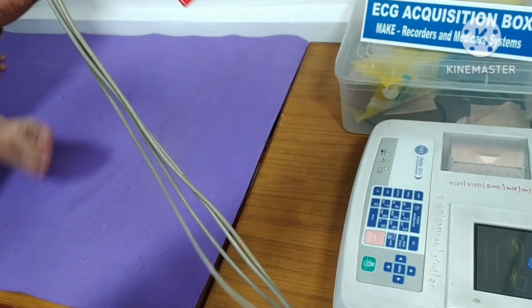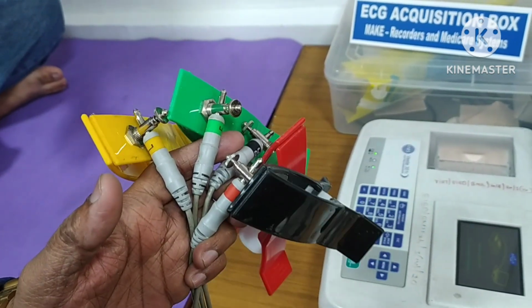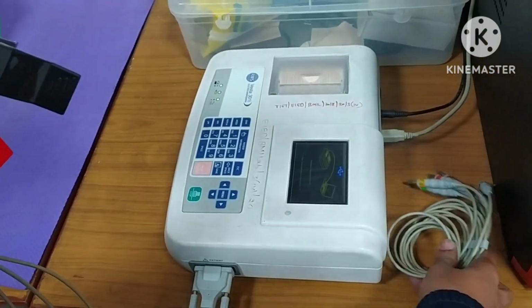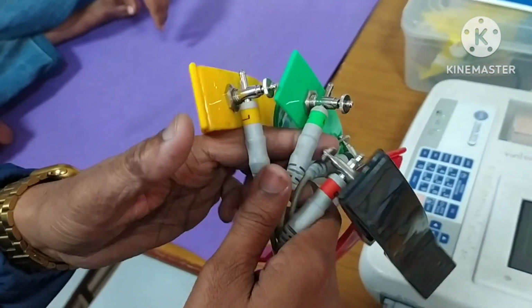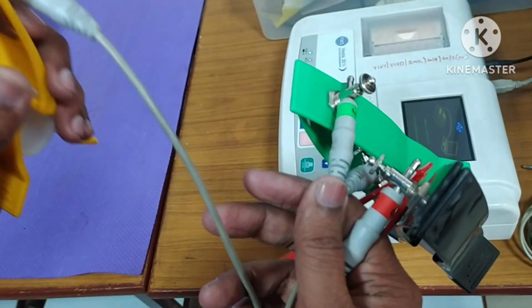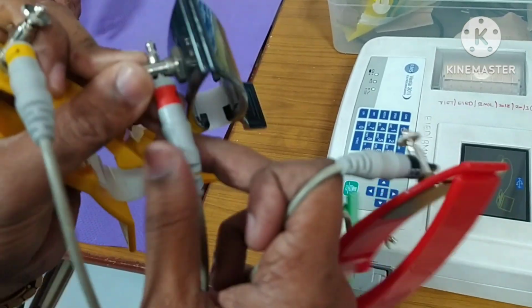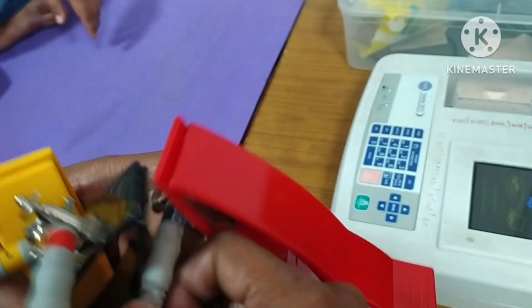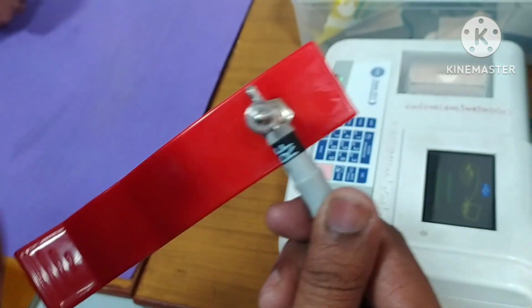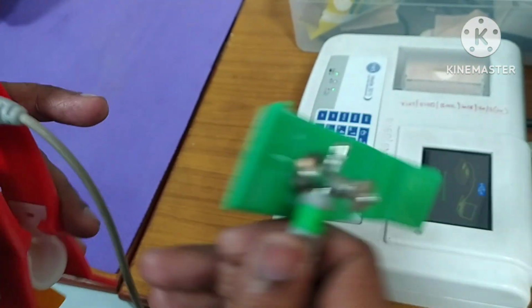So for practical or experimental purposes we use only 4 electrodes, and we didn't connect C1 to C6, the electrodes used for the chest. We are using only these 4 electrodes. The L electrode is used for the left arm, the R electrode for the right arm, RF for the right foot, and F for the left foot.